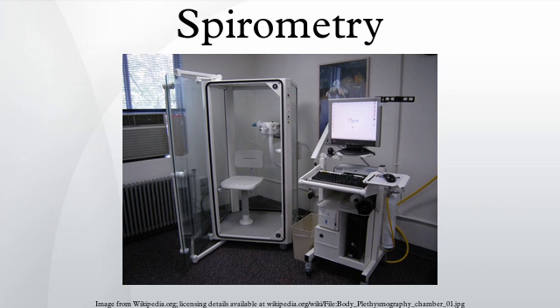Since air consists of very minute or trace quantities of CO, 10 seconds is considered to be the standard time for inhalation, then rapidly blow it out. The exhaled gas is tested to determine how much of the tracer gas was absorbed during the breath. This will pick up diffusion impairments, for instance in pulmonary fibrosis. This must be corrected for anemia and pulmonary hemorrhage.